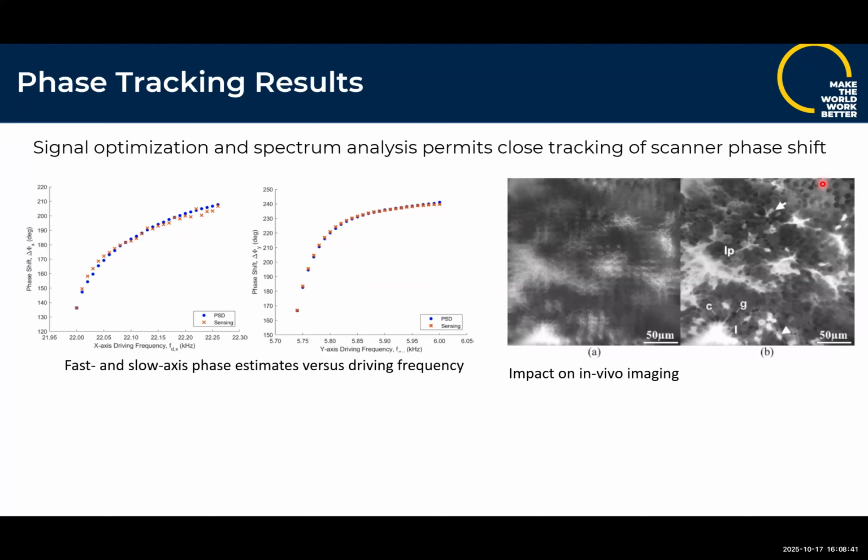I see. To do that on chip, you have to have what we would call a CMOS compatible process. Those are getting more and more common in the MEMS world. For one thing, this is all electrostatic, so you could do this in a CMOS compatible process. But my piezoelectric devices are not CMOS compatible, both because of the materials and the temperature used, for example. And so, there are folks. So would you ever do this? I'm not sure. There may be a point where it becomes cost effective, if there are enough of these things being produced, to do a CMOS integrated sensor.